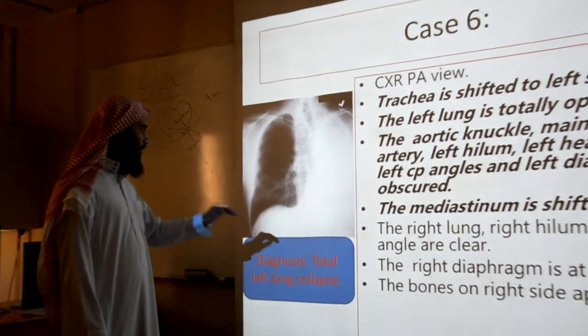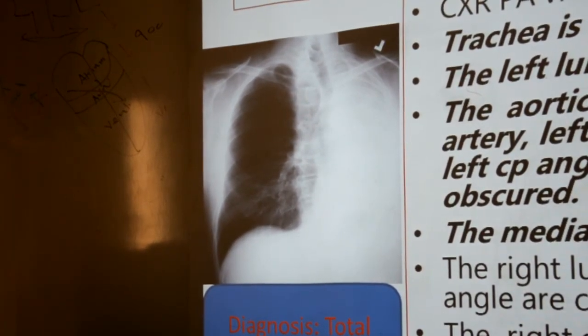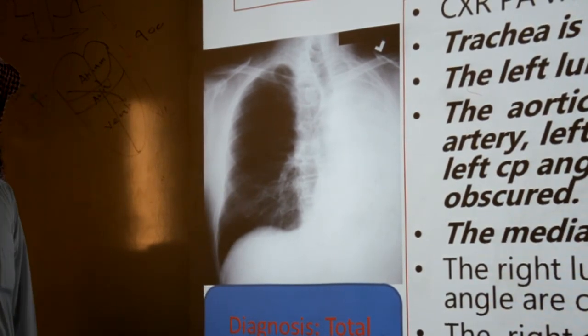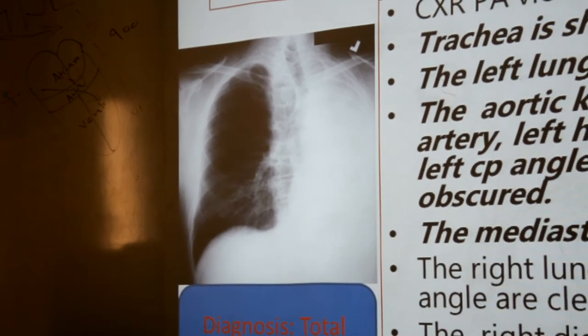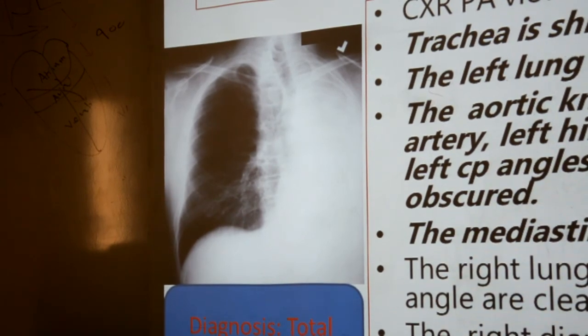Very good. Always say posterior anterior view of the chest. Be careful. If you only say posterior anterior view, I will think it's a posterior anterior view of the skull. This is the exam; I am preparing you for it. You have to say it because you must not lose the marks.